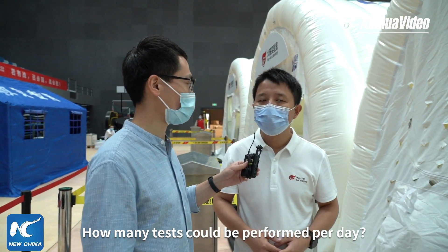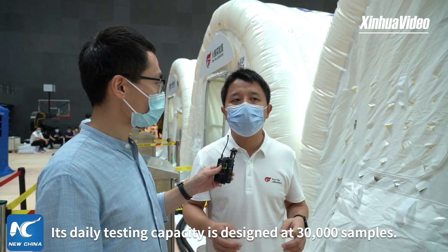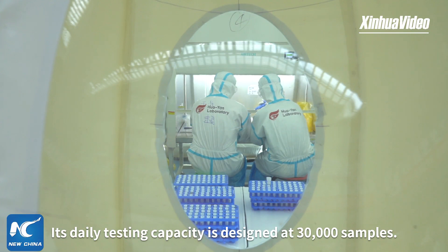那我们这里的日检测量可以达到多少？我们目前设计的每天检测的量会达到三万份。(What is the daily testing capacity here? Our current designed daily testing capacity can reach 30,000 samples.)